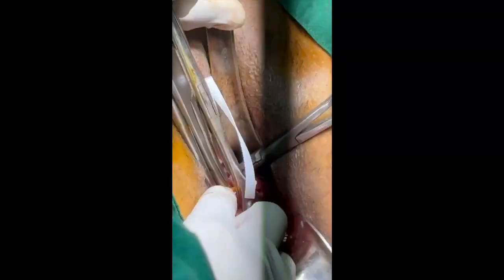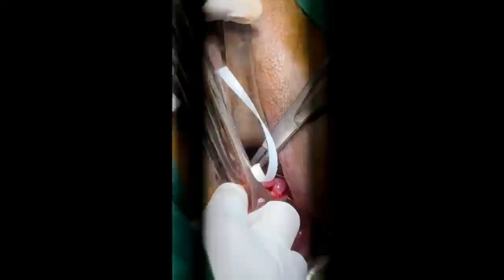The Foley's was dilated with 20 cc of distilled water, and this is how we are creating the space between the cervix and the vagina and bladder so that we can reach the internal os. It is important in this step not to injure the membranes. And now the stitch is being taken.